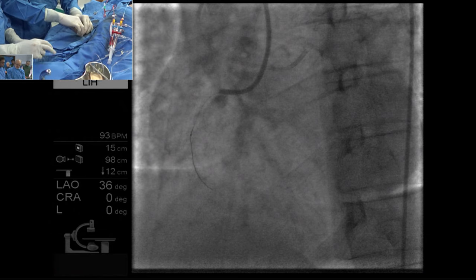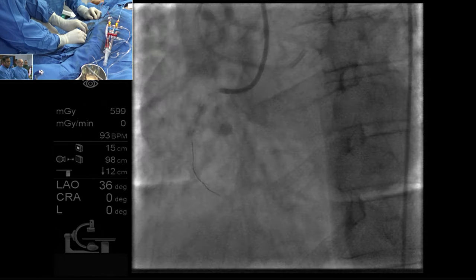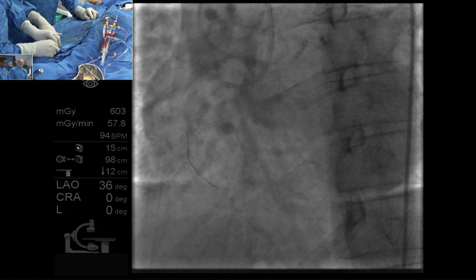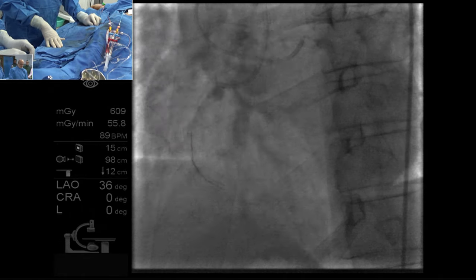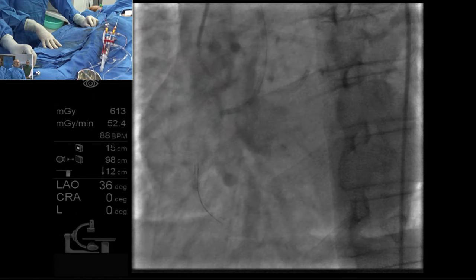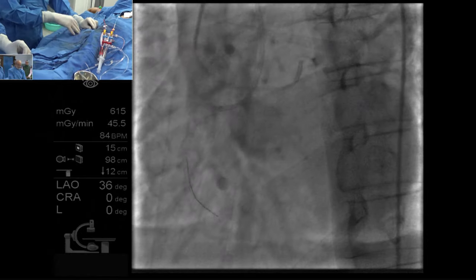Has it come out? It has not come out. So you are going to trap it now. Let's see, otherwise we'll cross it. Trapping and things, you know, we do when it is a very desperate situation. You can use the Nanto technique, the one with the 16 atmosphere. Dual lock. You could just put a 3cc syringe on too.